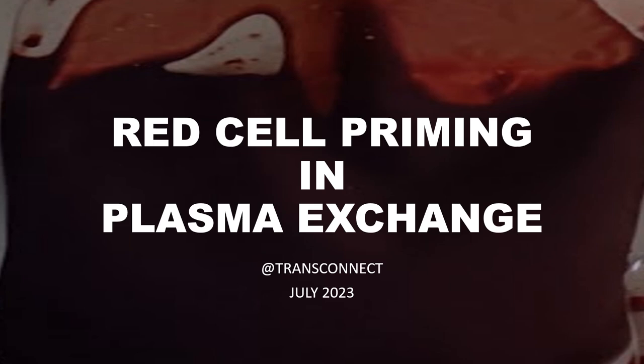Hello friends, today we will be seeing a small video demo on red cell priming in plasma exchange.